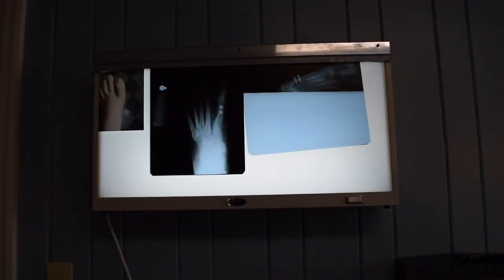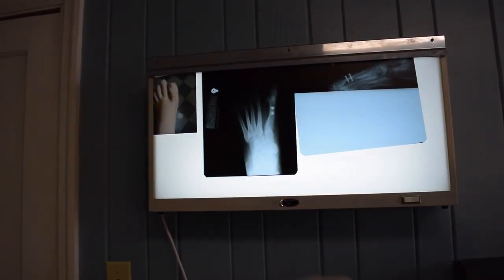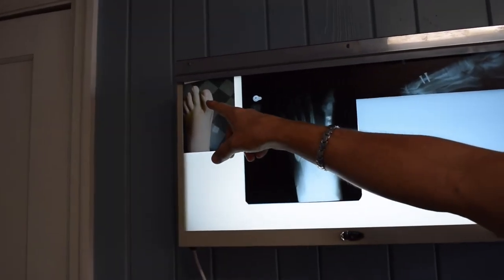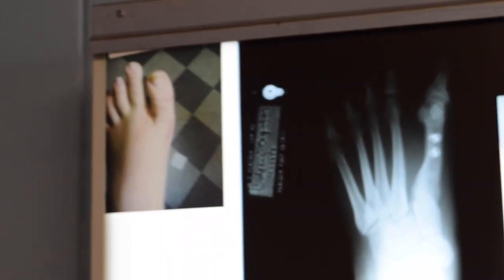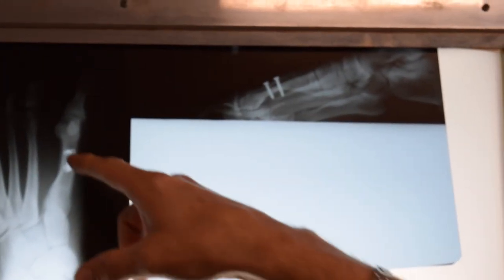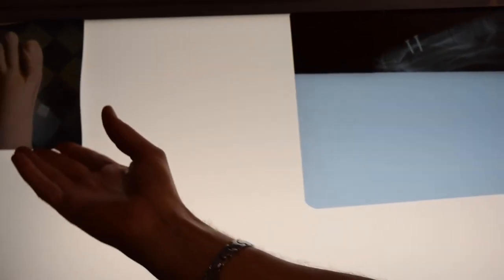Okay, here's an examination of the patient. Here's a picture we took preoperatively. This is the foot she had the traditional surgery done on. You can see, look at all the scarring she has. This is a fairly young girl. She actually got a lot of shortening of her bone as well here, and her Hallux is very short. She had a fairly significant, looked like a mid-shaft osteotomy performed, and two screw fixation. A lot of Hallux Varus issues here. So let me just give you a head-to-head comparison of her other foot, and we'll show you a picture of that as well in a second here.